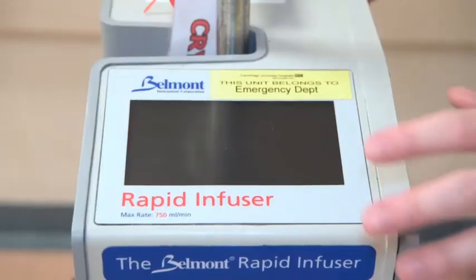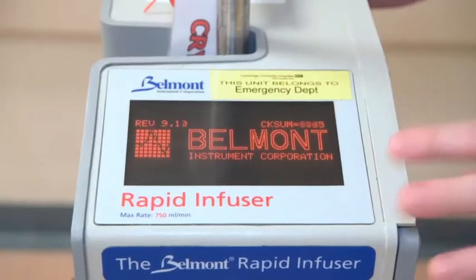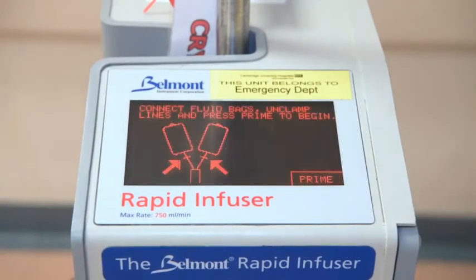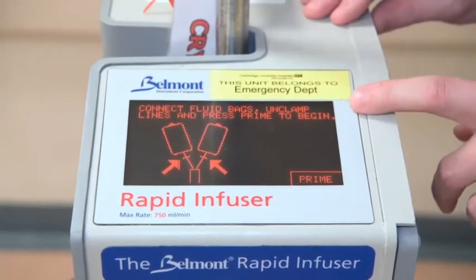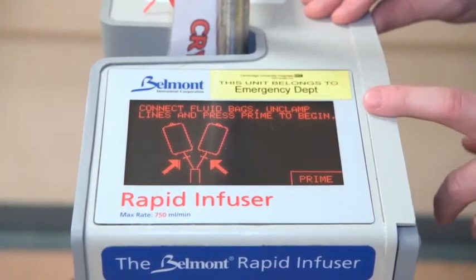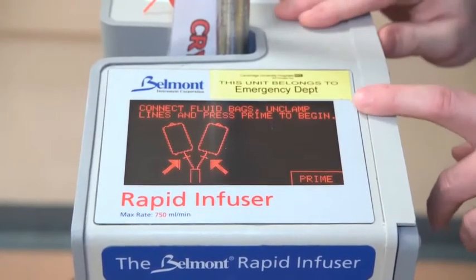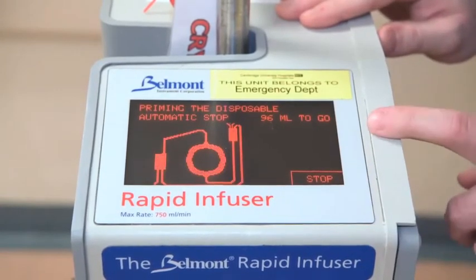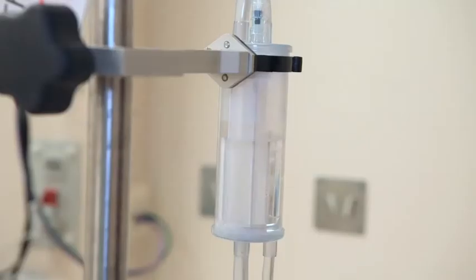Now we can fully prime the cassette. Press the button on the back nice and firmly to turn it on, and just allow it to go through its service interval first. Note that if you have turned on the machine before connecting anything up, it will instruct you anyway, so you haven't got to worry. Now you can unclamp all of those clamps — that will fill the chamber up — and then press prime. By pressing prime, you'll prime 100ml through to the cassette inside the Belmont itself. The Belmont will automatically stop once it's primed and removed all the air from inside the cassette.